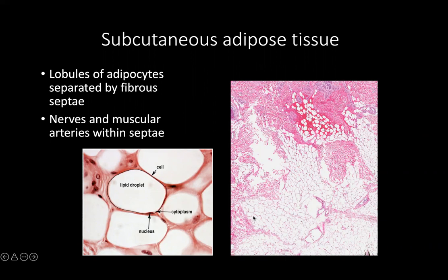The subcutaneous tissue has septae and lobules. Septae are the thicker collagen divisions between these lobules, which are made up of mostly adipocytes. Depending on where the inflammation is in a panniculitis, you're going to be able to call it septal or lobular. Septal, the most classic example is erythema nodosum, which develops as deeper seated nodules on the legs most frequently, sometimes after infection. It could be associated with other systemic diseases. And lobular panniculitis, the list is too long to mention for this lecture, but just understand that there's a whole host of entities that can lead to lobular panniculitis.